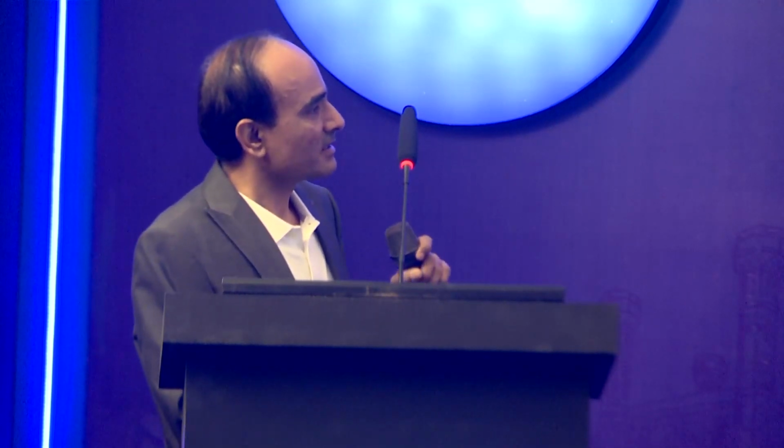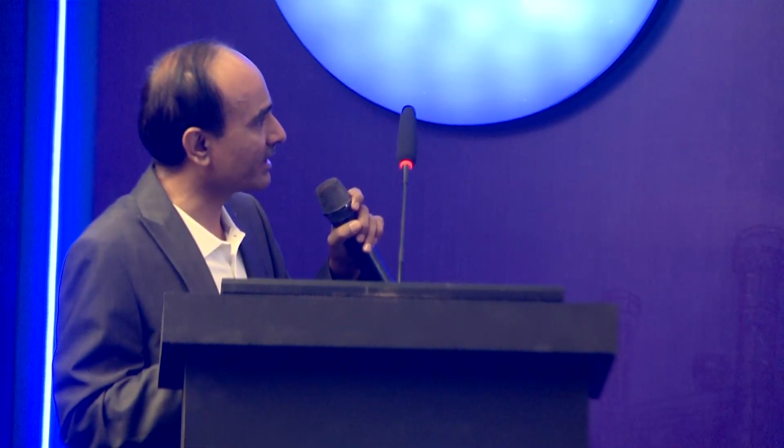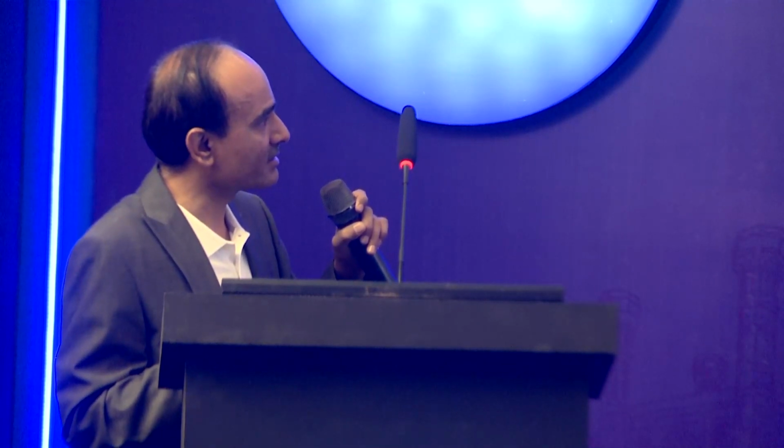So anyways, that kept on slipping. Various maneuvers were used to get this out. In the first slide, unluckily the laser is not visible because it's not dark enough. In the first scene, what we tried was to remove all the equipment, including the guide and the wire, and this dislodged stent balloon as such.